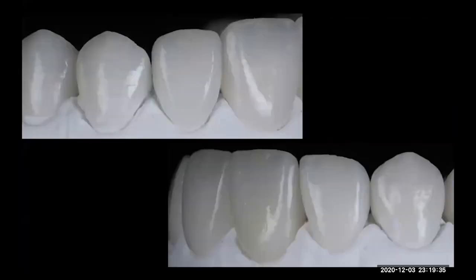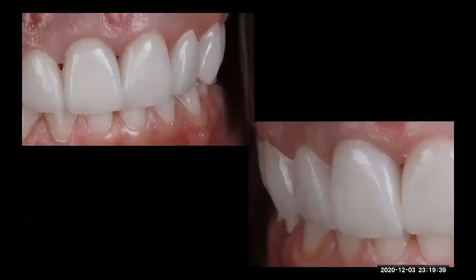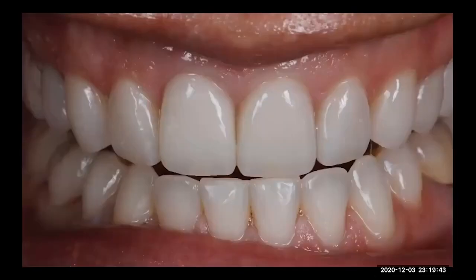This is the case finished in the solid model. And this is our try-in. Okay. And this is the case like 6 months later. You can see all the effects you see in the incisal edge are from palatal.